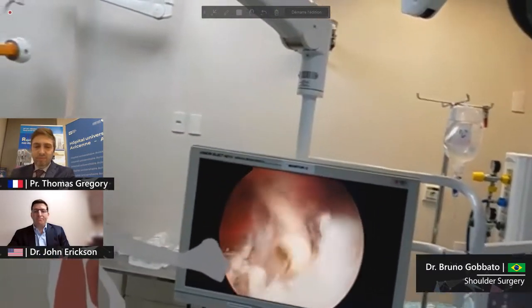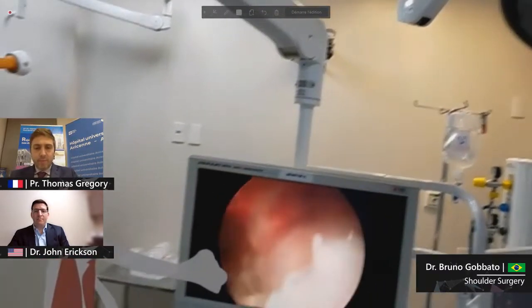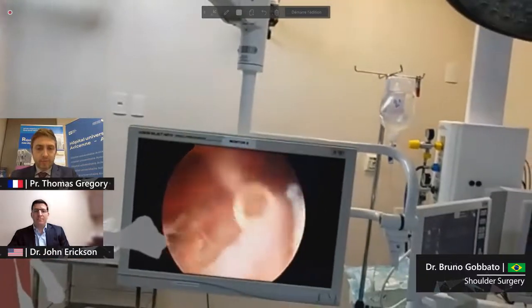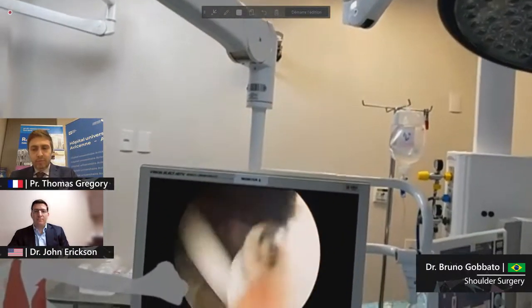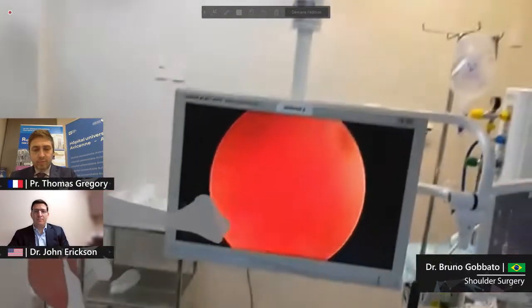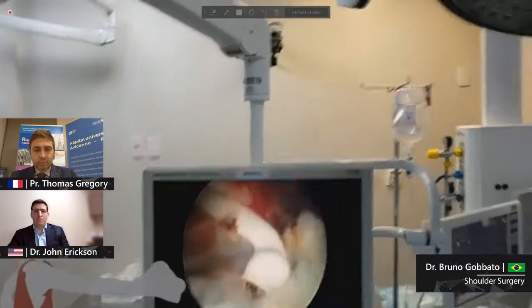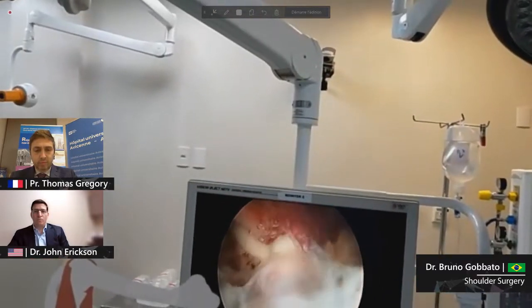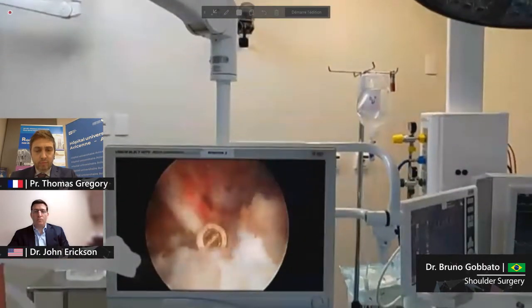Maybe even in a small surgery, to see the patient notes from your office or the hospital. If I have some doubt, I can look it up. I can check, as Thomas said, on other surgeries also. We can have our experts, just like you, being in the surgery actually.